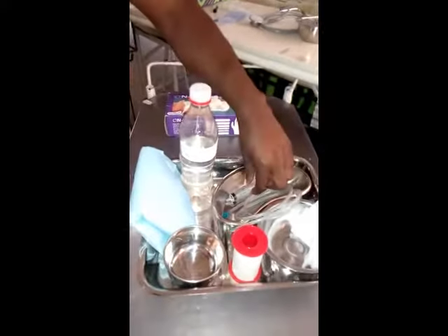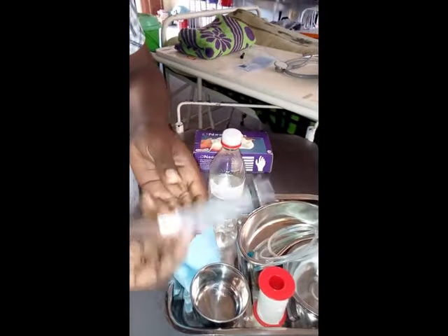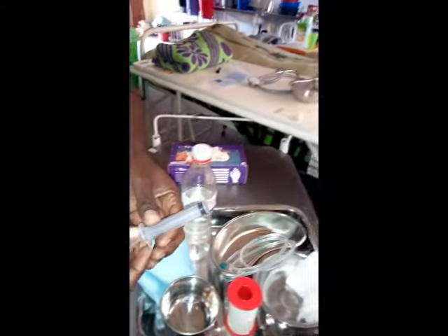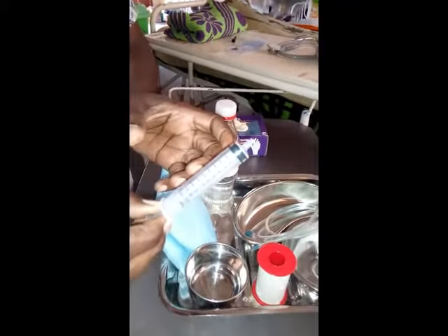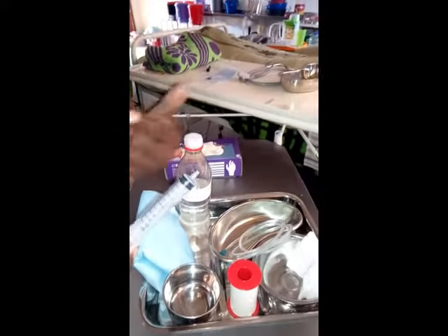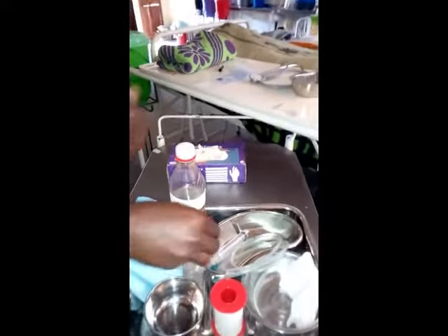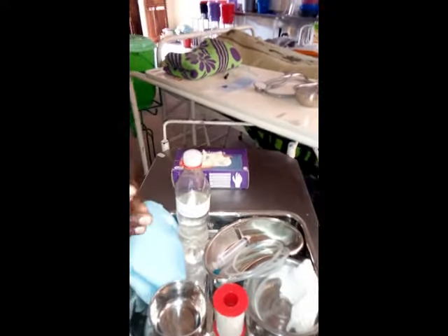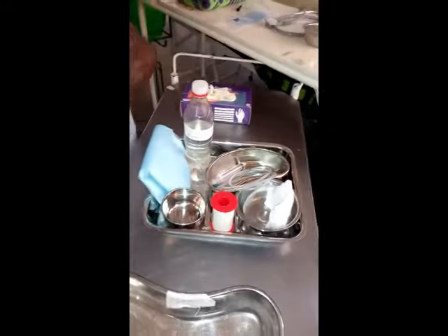Then we have a syringe. This syringe is a 10cc syringe. It is for testing if the nasogastric tube is in situ. You're going to see as we do the procedure how we test. I brought it here because mostly in OSCE this is what we want. Even in practice we want this to be as simple as possible. We don't want to complicate matters.